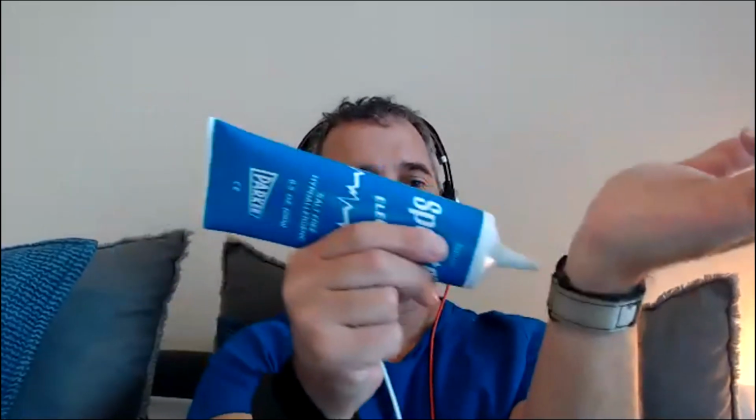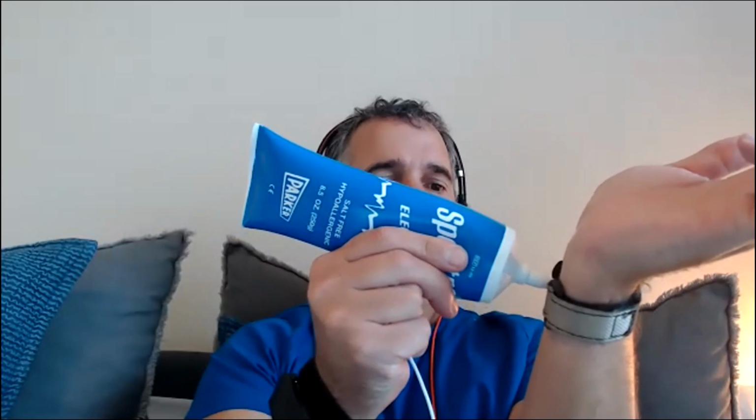Not too much, a little bit there, maybe loosen my other strap over here, rub them on both wrists. I also might, if I'm having major issues, put a little bit of electrode gel on each connector right there. If your cords have a loose connection, sometimes that can be an issue. I've had people who had to get new cords for some reason, okay? I've had people who were doing yard work with their Healy and cut their cords and have to get new cords for that reason as well.